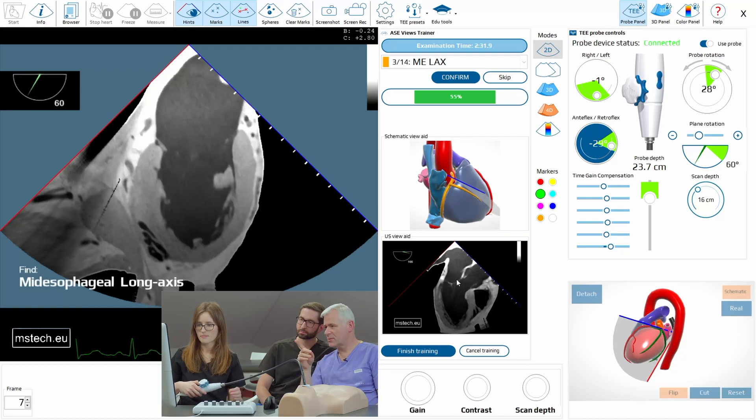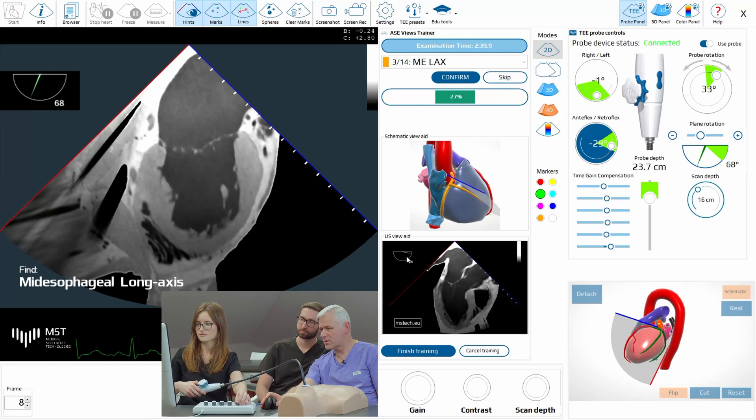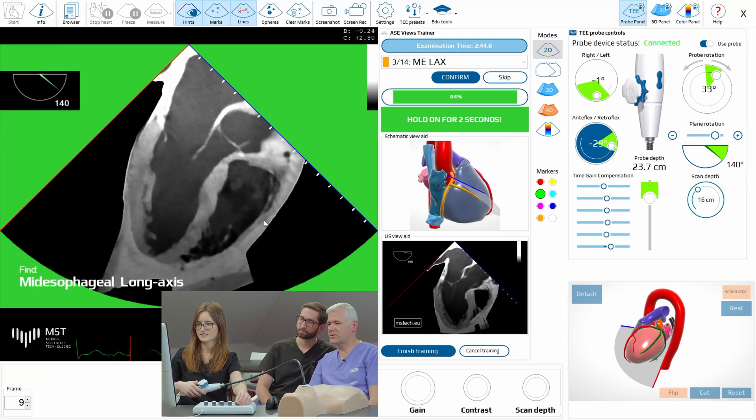Now middle esophageal long axis, which means you have to see LVOT. So now we have to go — you can have a look here. You see the angle? Yes, 150. Very close. Good. Perfect.